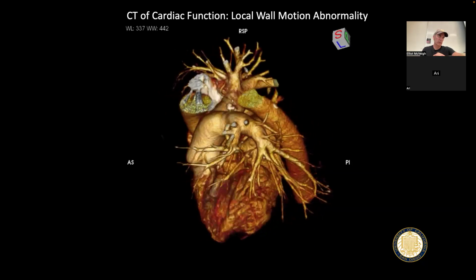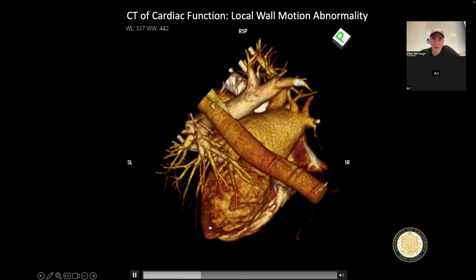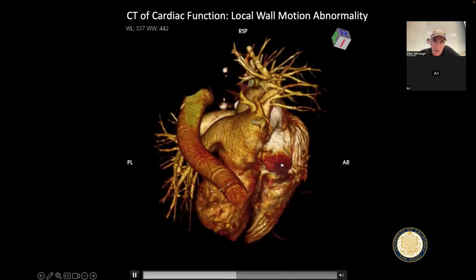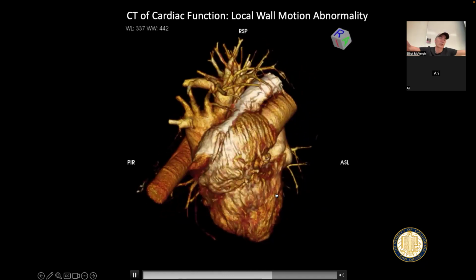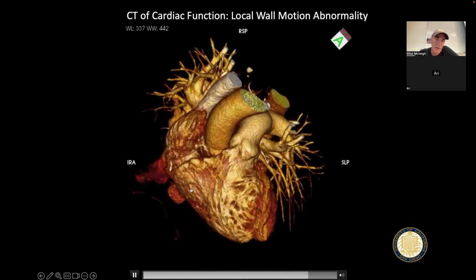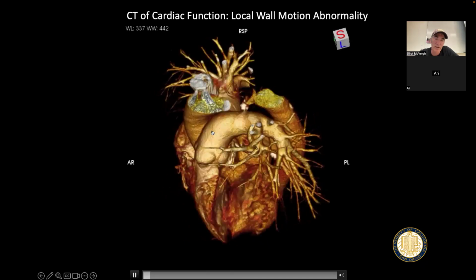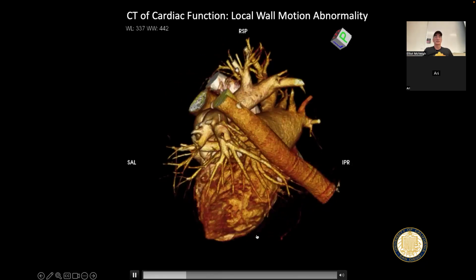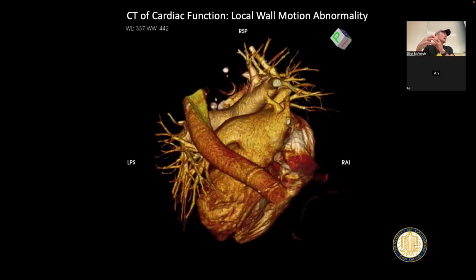Going back to the ventricle, here's the left ventricle in a 4D CT of a whole heart, obviously, but this piece down here is the left ventricle. This is the right ventricle over here. This is the right atrium, the left atrium, the aorta. So everybody's full of contrast during this single beat. We can see the right ventricle contracting. This is the surface of the right ventricle, pushing blood out through the pulmonary artery. It's going towards the lungs. And then here's the left ventricle and the septum, but look at this thing here. That feature is just like this ball of tissue that's being dragged around. It is not contracting, right?